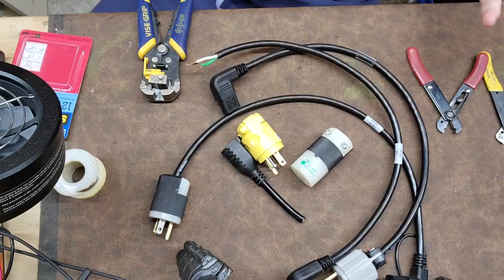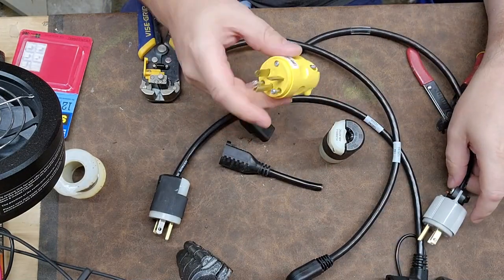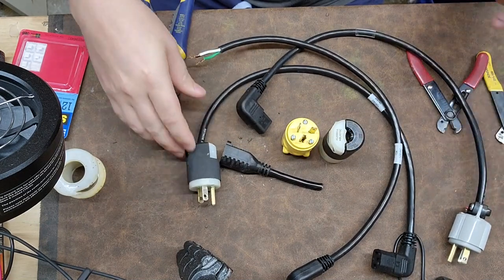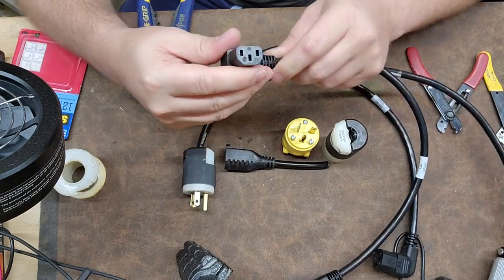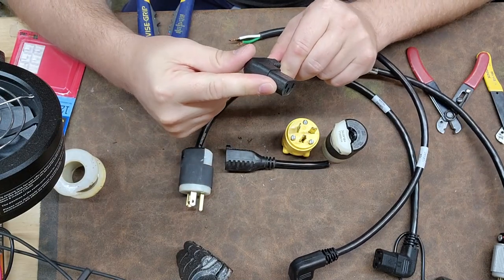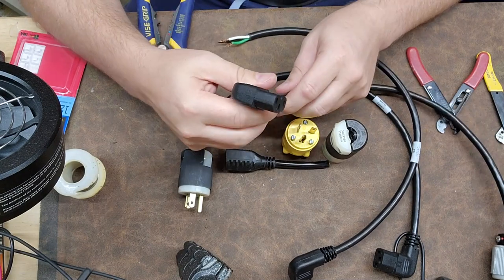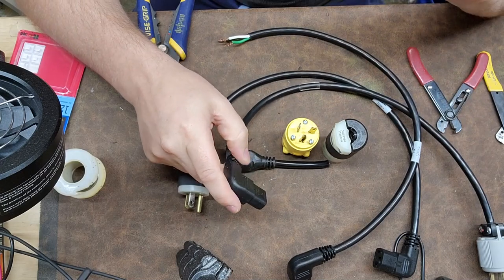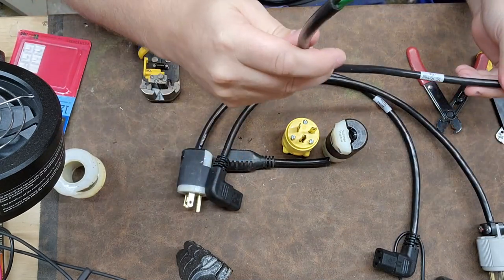Here we go. I've got a couple different types of plug-ins here. This one is a 20-amp, here's a 15-amp, here's a hospital-grade 15-amp, and we also have this style connector which is your IEC female connector — you can get replaceable ones of these as well. It doesn't matter what end of the cord you're working with; there is a correct way to install a cord.